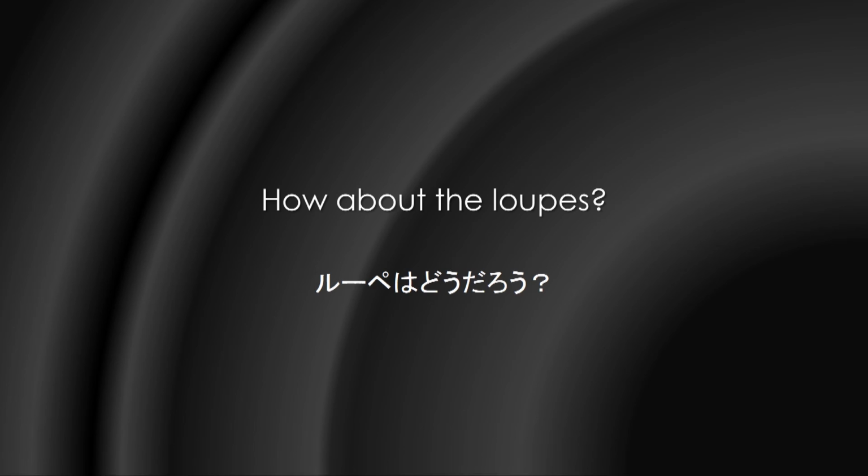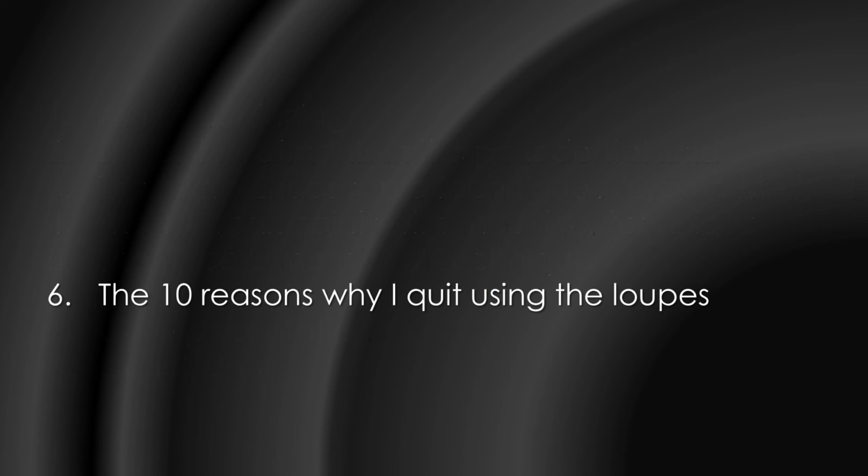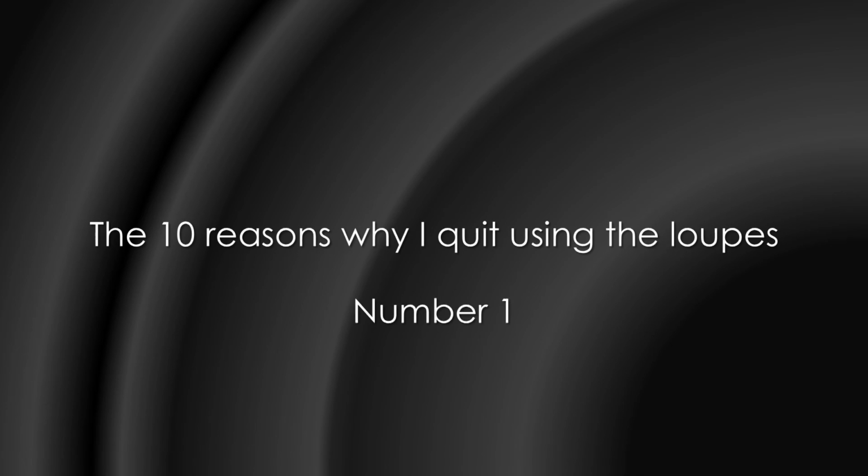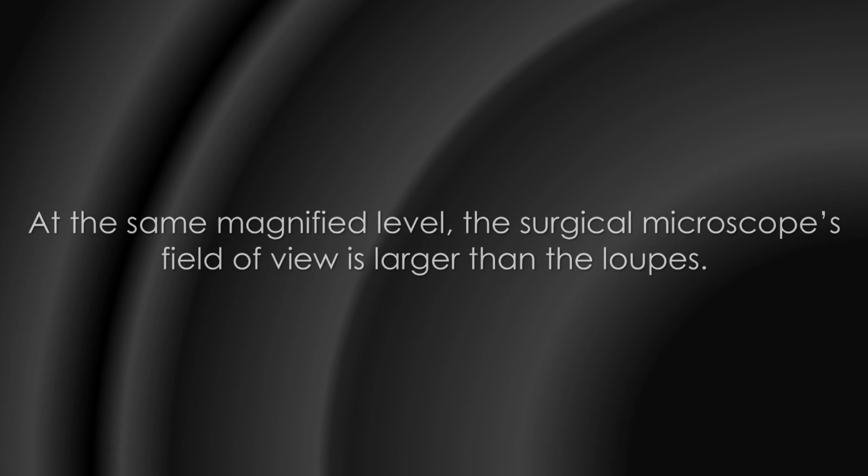How about the loupes? Number 6. The 10 reasons why I quit using the loupes. Number 1. At the same magnification level, the surgical microscope's field of view is larger than the loupes.